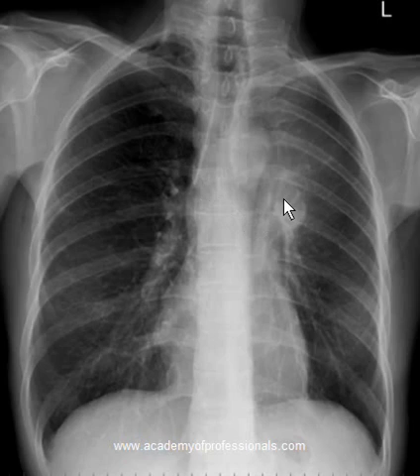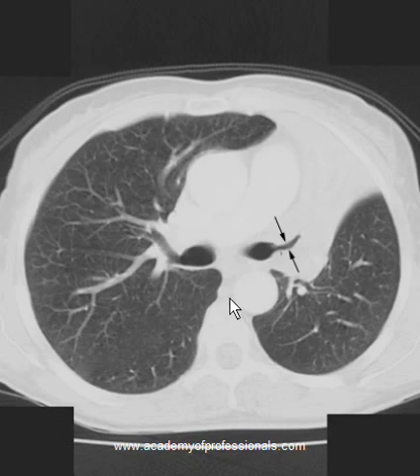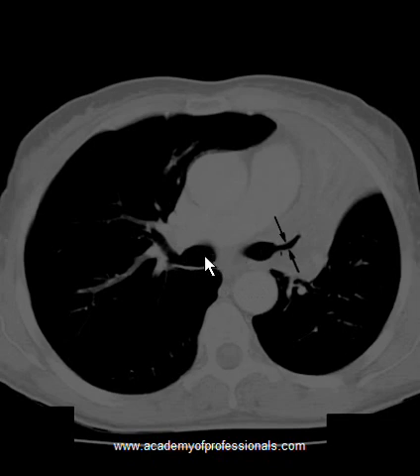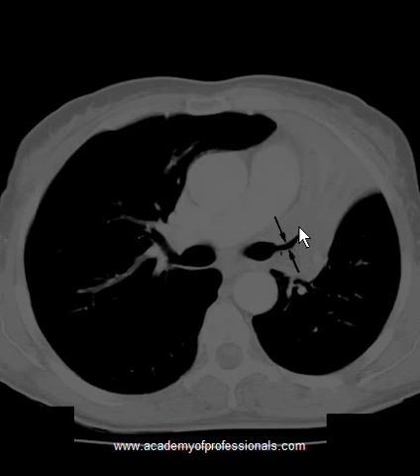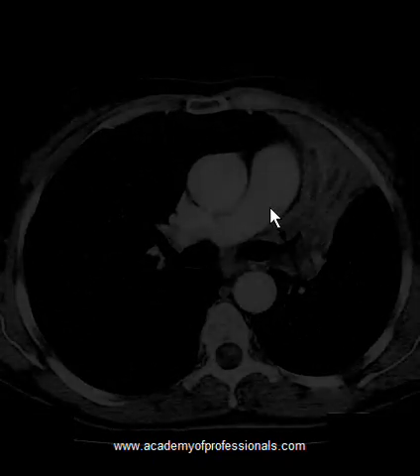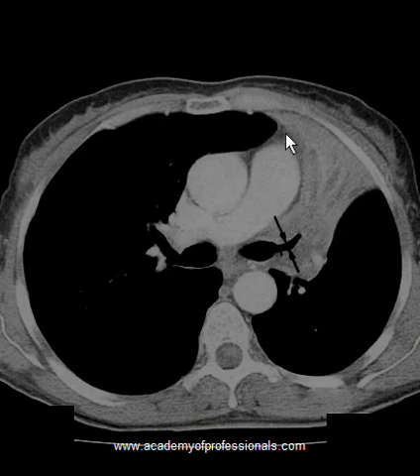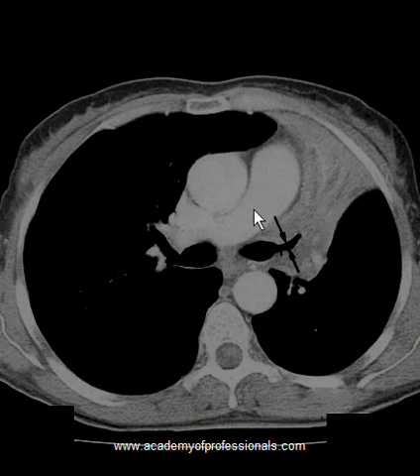I would also like to show you an axial CT scan slice. This is the left main bronchus and right main bronchus just after the bifurcation. This bronchial branch was supposed to supply air to the left upper lobe, and as you can see, there is no air supply from this point onwards. This is airless, collapsed lung tissue, with the main pulmonary artery, ascending aorta, and descending aorta also visible here.